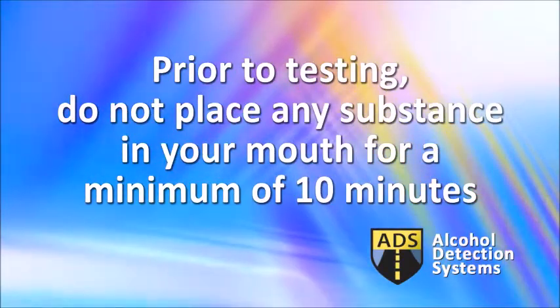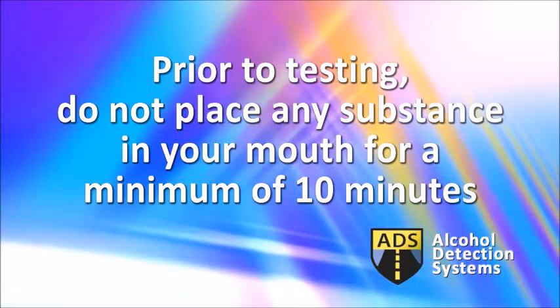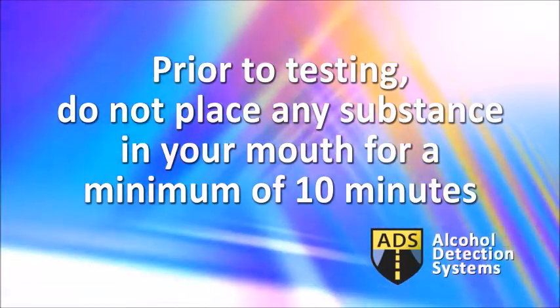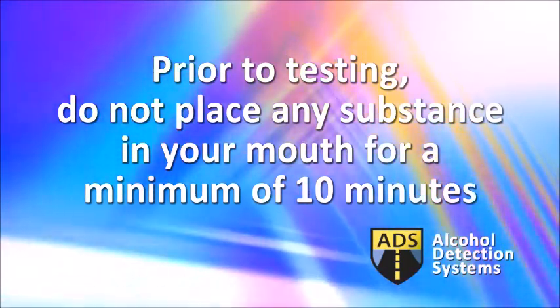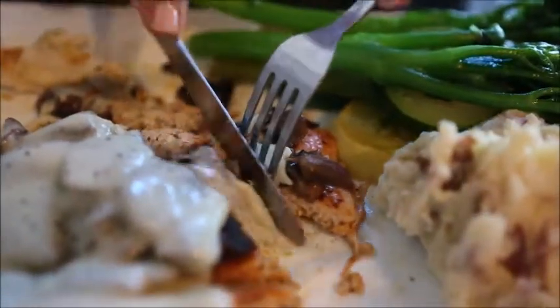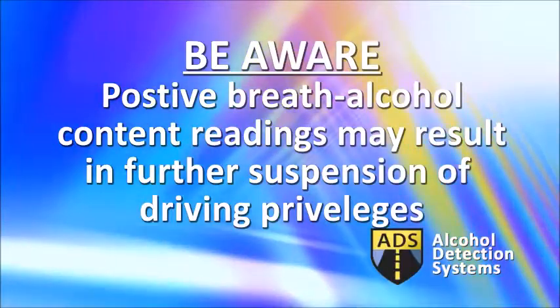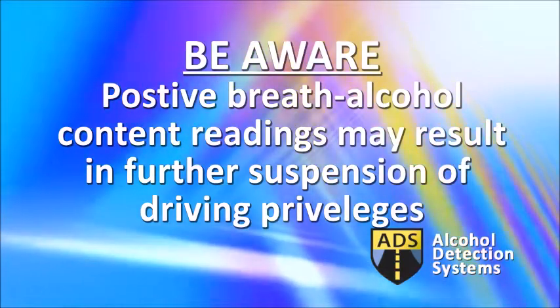Prior to taking any breath alcohol test, it is important that you do not place any substance in your mouth for a minimum of 10 minutes. This is the most common mistake made by our users. If you eat, drink, use mouthwash, or smoke within 10 minutes before providing the test, the test may be affected. Always be conscious of your exposure to alcohol.